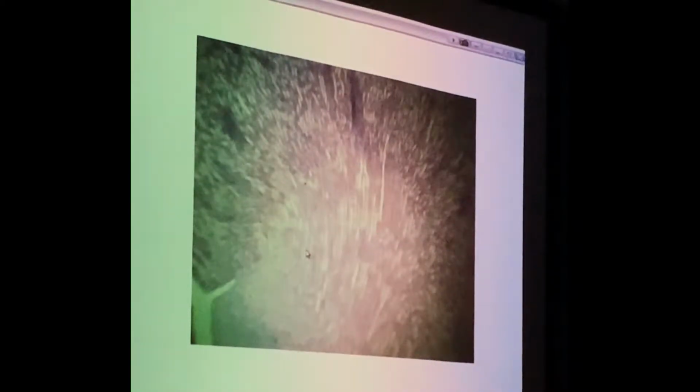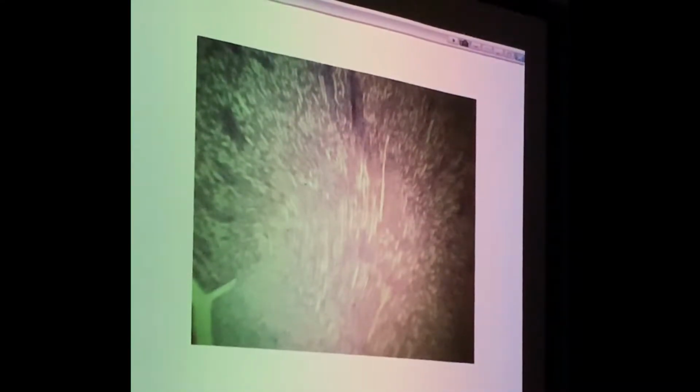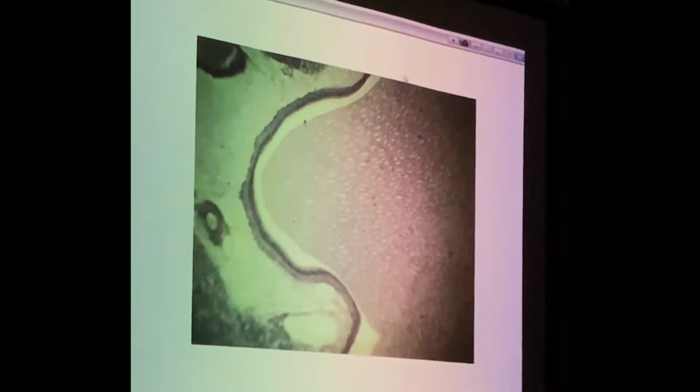And then as I go deeper into the medulla, I'm going to remember the medulla is going to have the ends of the loops of Henle. So here's some loops of Henle, and it's going to have collecting ducts. And by the time I get to about here, all I'm seeing are collecting ducts. So all of the tubes are kind of running in the same direction. And then somewhere down here, they're all going to kind of come together, and they're going to leave really what's the kidney and go into the pelvis, which connects to the ureter.